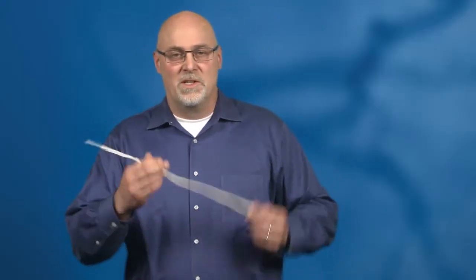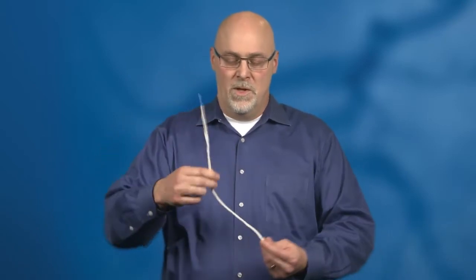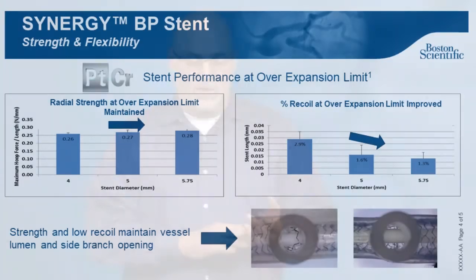Again, if I go to this simple piece of wire, what is stronger, a column, a straight column, or a column with a bend in it? All right? Obviously, a straight column is stronger. So when you over-expand stents and post-dilate them, essentially you're bringing the struts closer and closer to that perfect column, so therefore you gain radial strength as you over-expand stents.